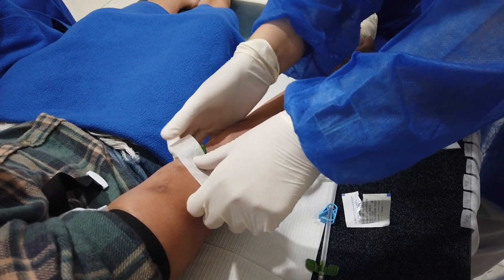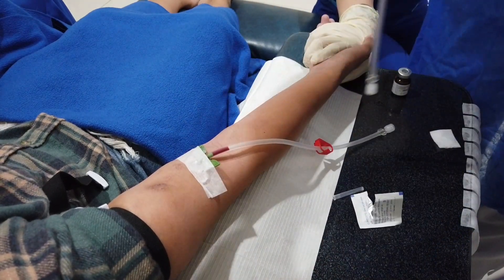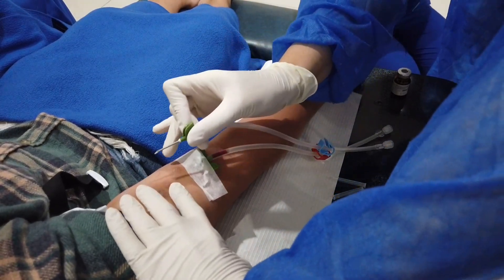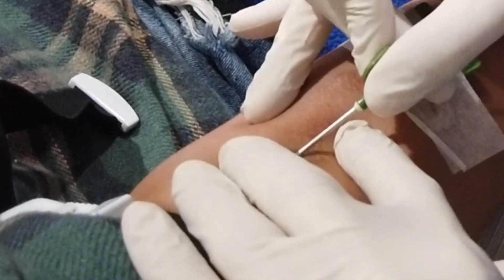Secure the wing with plaster. Do the same with the remaining site. The patient's vein at this site has a bit of resistance inside, which you can notice in the video.